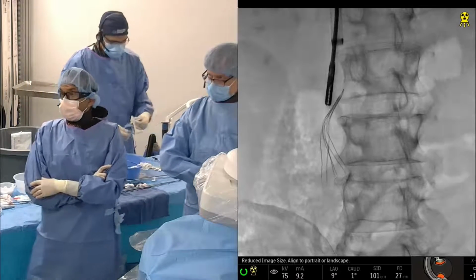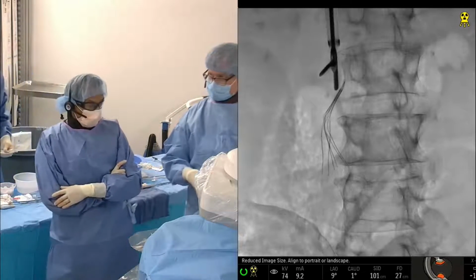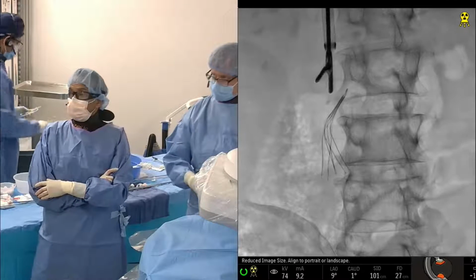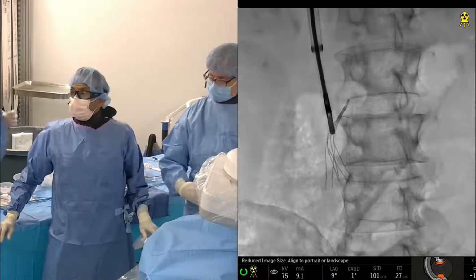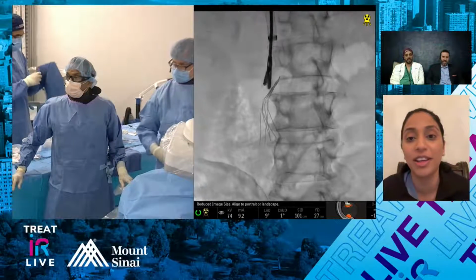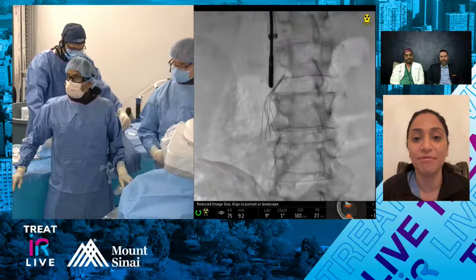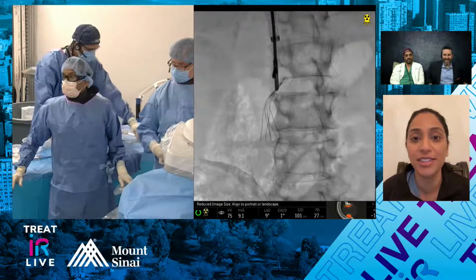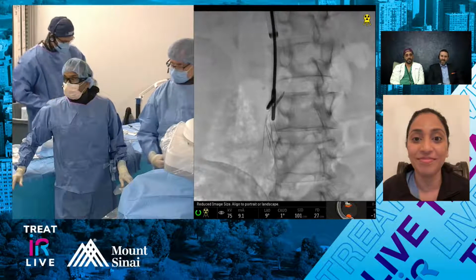If you have one view, it is not reliably and regularly available. That's why we've been angling the tube a little bit every so often. There are also some considerations with biplane, having anesthesia there, and you're working at the head. It gets really busy really fast, with limited real estate. I don't know how your rooms are at UCLA, but our rooms are tiny, as you remember.